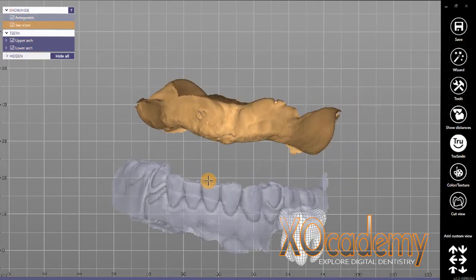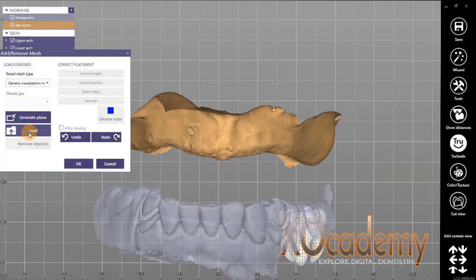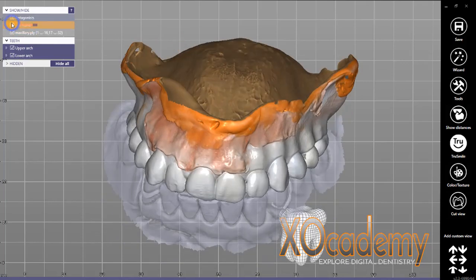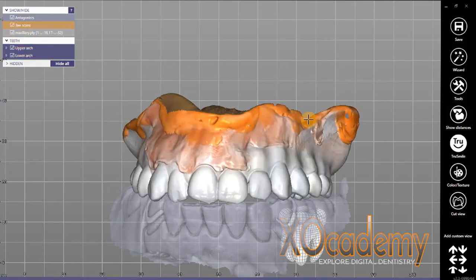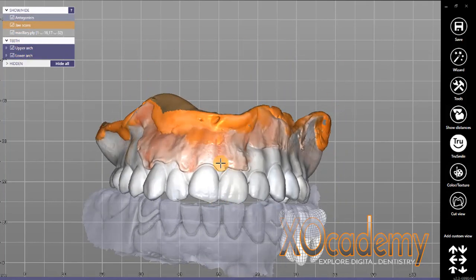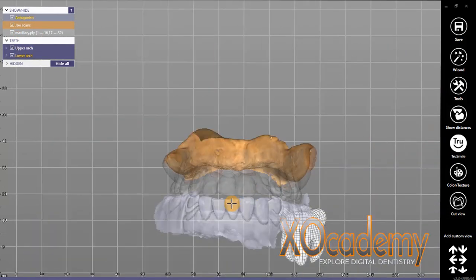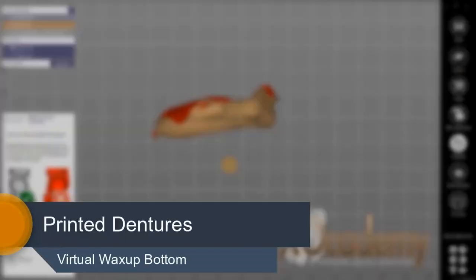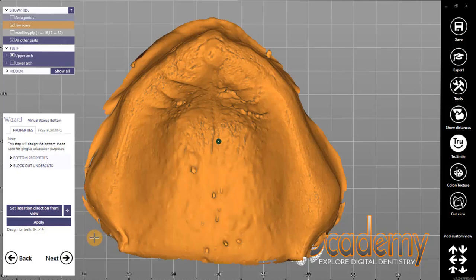ExoCAD does more than just designing crowns and bridge work. Now we have our upper arch in relation to the lower arch and I brought back in that original scan so you can see the upper arch is in the same position. In this particular case I wanted the midline right on — the rest of the teeth weren't in occlusion great but the midline is great.